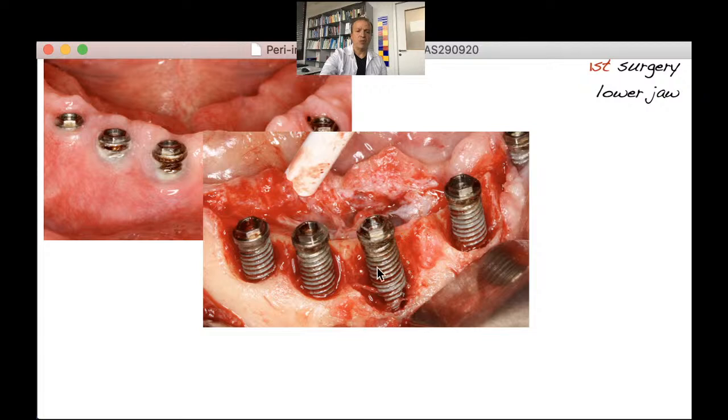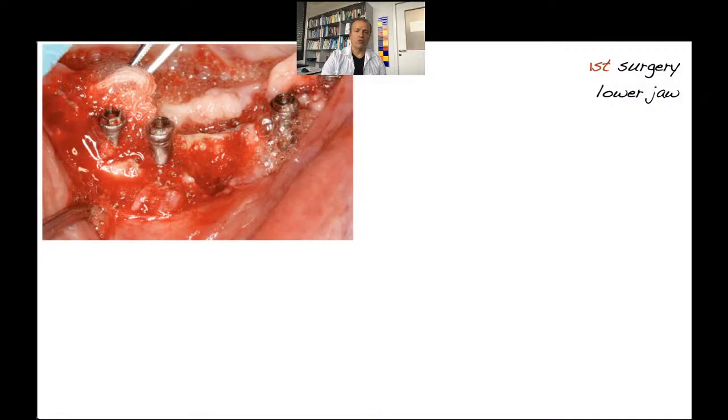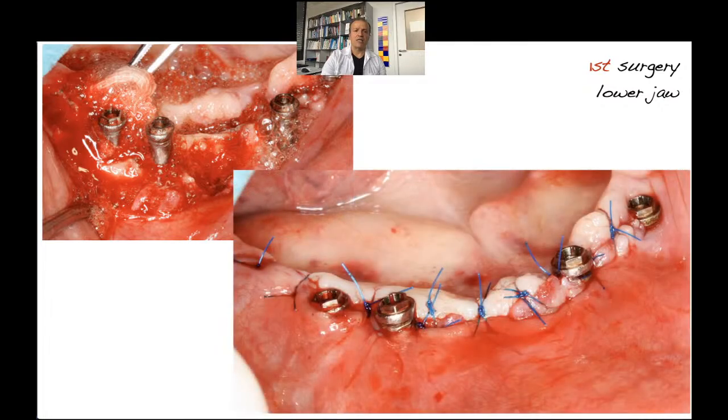So this implant was removed, and then the 4 remaining implants that were sitting quite well in the bone were treated with a resective approach with implantoplasty, where threads and surfaces were polished, and then of course we decontaminate with hydrogen peroxide and a gauze with sterile saline, rinsing away the remnants, and then just clean up and close up, so no attempt to regenerate.